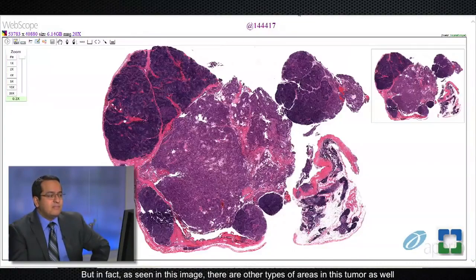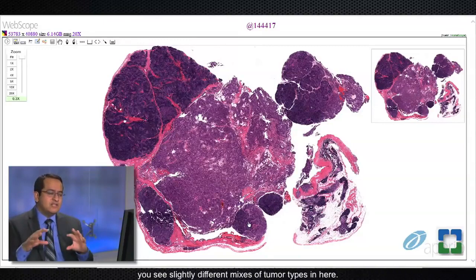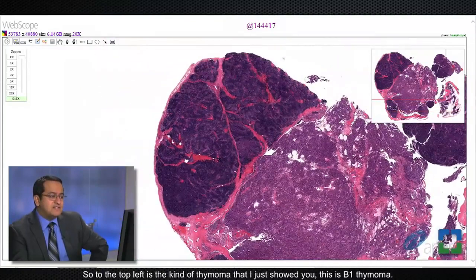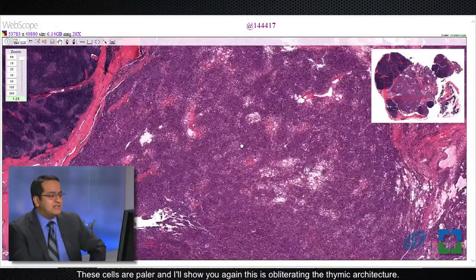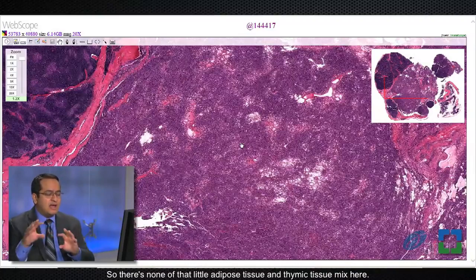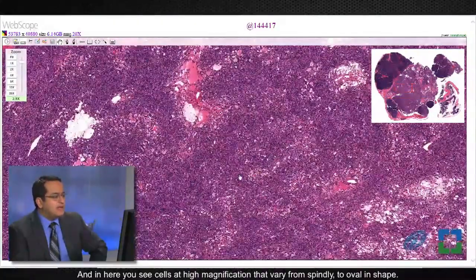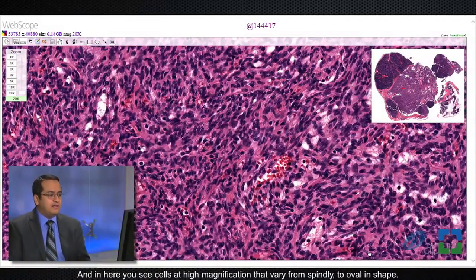As seen in this image, there are other types of areas in this tumor as well, and it's not at all uncommon in thymomas that when you go from section to section you see slightly different mixes of tumor types. To the top left is the B1 thymoma area I just showed you, but as you go to the bottom right you see something else — these cells are paler. This is still obliterating the thymic architecture, with none of that adipose tissue and thymic tissue mix. In this area at high magnification you see cells that vary from spindly to oval in shape.